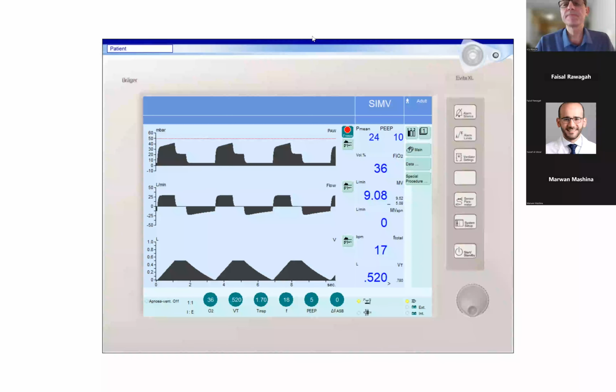I'm gonna get rid of the time that the patient spends in the plateau. Excellent. See that time? So this patient, he's on 36%, by the way, here. And this time is inspiratory time that we're doing nothing in it. Okay. So you can see zero flow, and we're holding the breath inside the chest. Why are we doing this? There's no reason why we're inhaling and putting a plateau in the system. You can identify the problem by doing this, but the only reason why you would hold the air in the lungs is if you want to improve oxygenation. Here we don't have problems with the oxygenation, so we should get rid of this first.